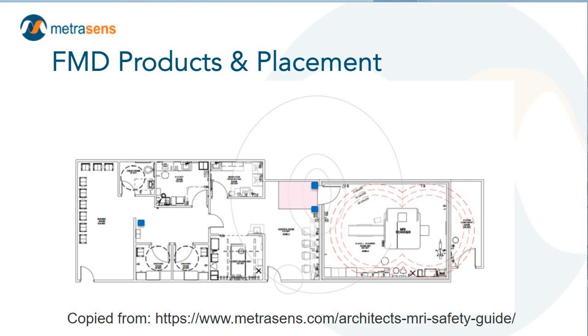Once we have the patient changed, prepped, and their belongings in a locker, we do a QA/QC with a screening ferromagnetic detection device in the patient changing area. If it turns out they have something, we can have them put it in the locker right where they're at. But you notice in this layout, we also have a quote-unquote back door, a staff entrance or inpatient entrance into the MR control room. We have a way to circumvent that screening function if you come in the back door.